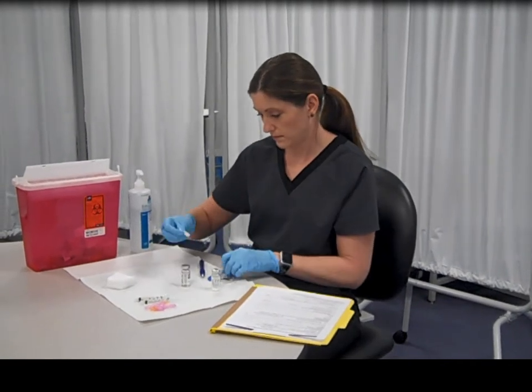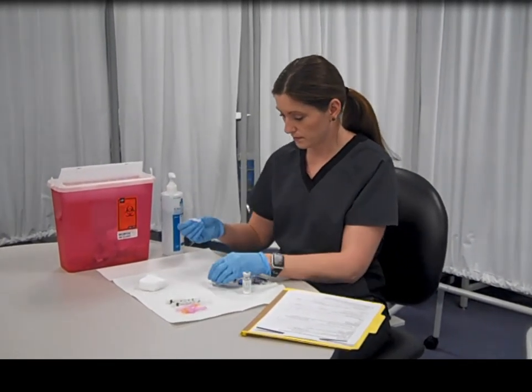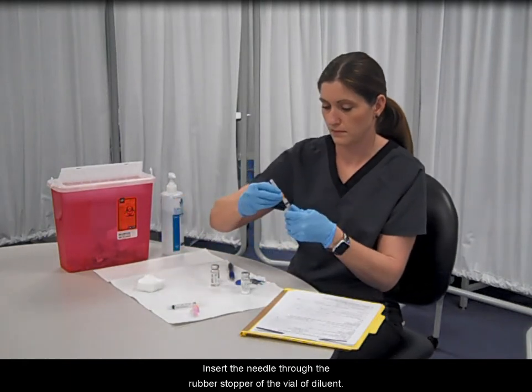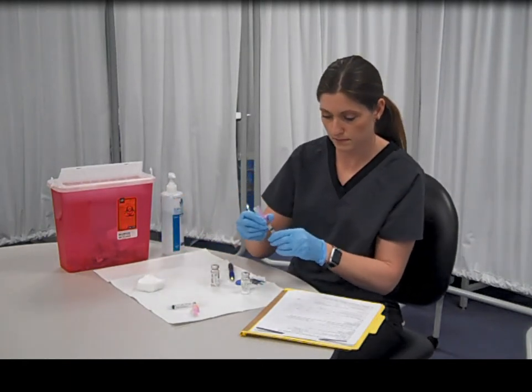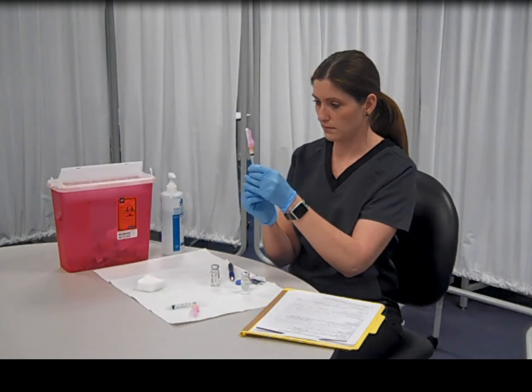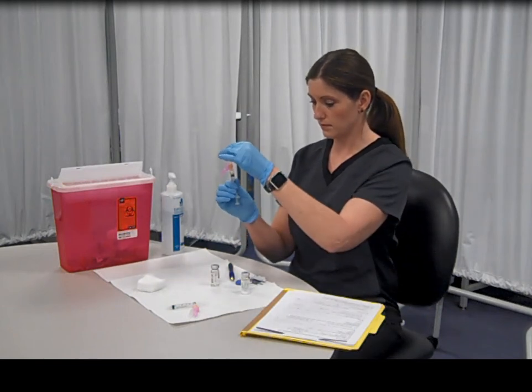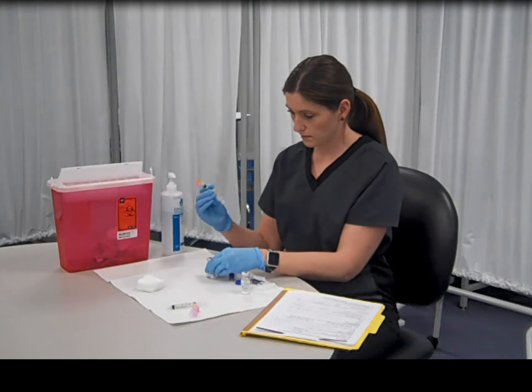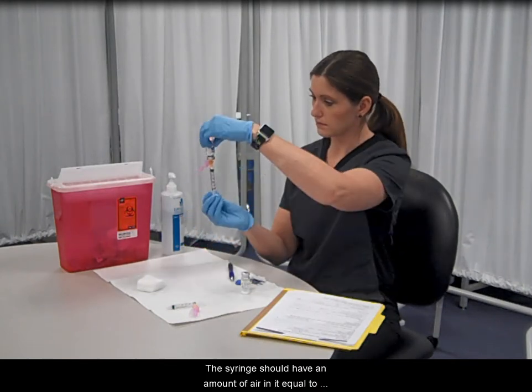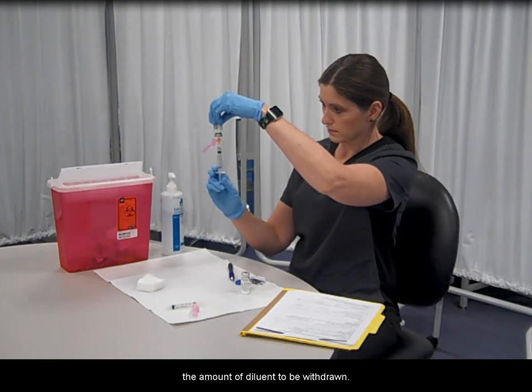Insert the needle through the rubber stopper of the vial of the diluent. The syringe should have an amount of air in it equal to the amount of diluent to be withdrawn. Invert the vial and needle and syringe unit and withdraw the appropriate amount of diluent to be added to the powdered medication.